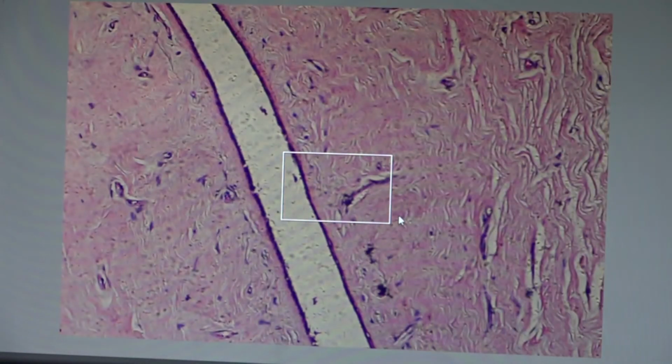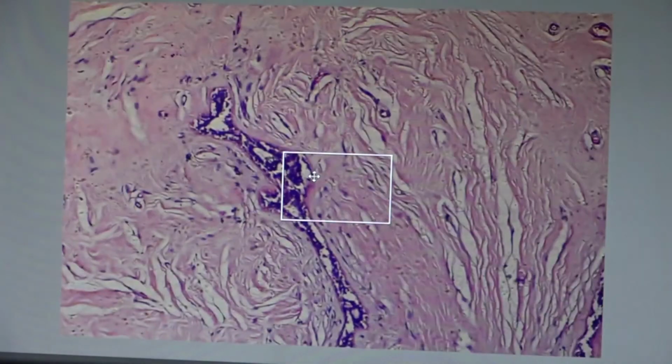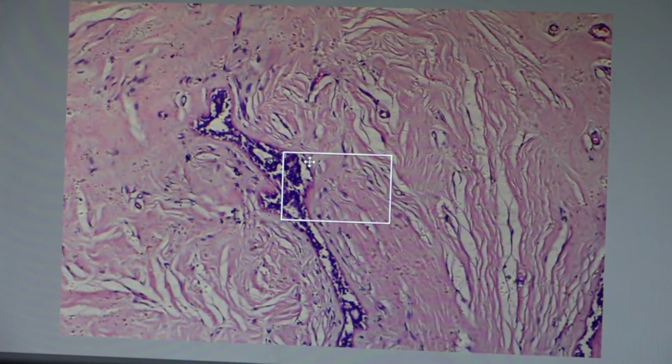This lesion also shows a glandular slit. This lesion also has benign-looking glands and stroma, with evidence of whirling appearance. It is like that of the adenofibroma or fibroadenoma of the breast. This is called adenofibroma. In the breast it is called fibroadenoma. No evidence of atypical or malignant change. This is adenofibroma of the uterus.